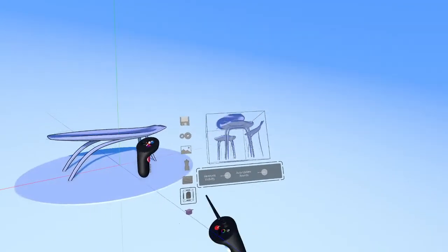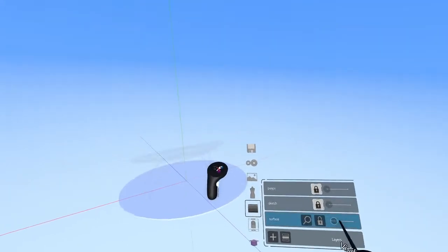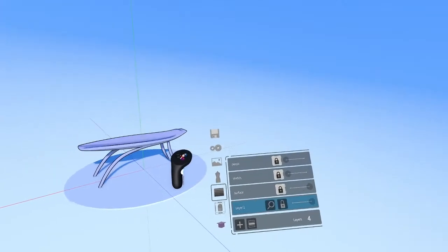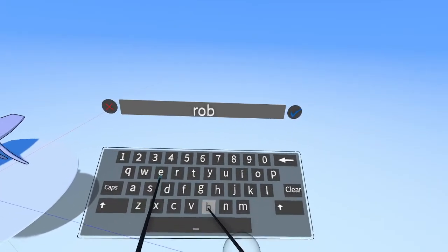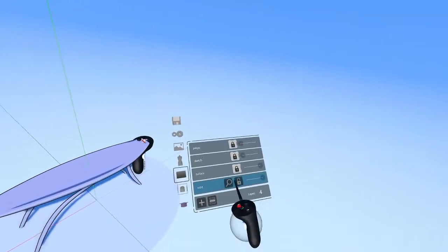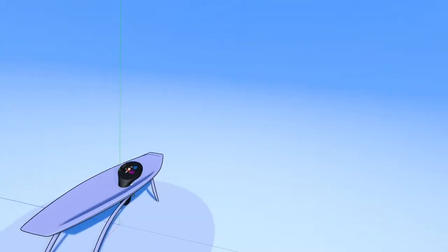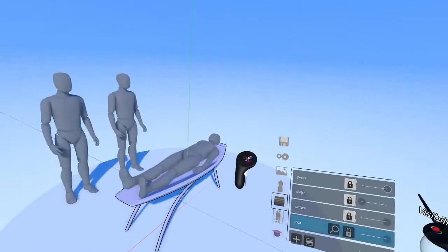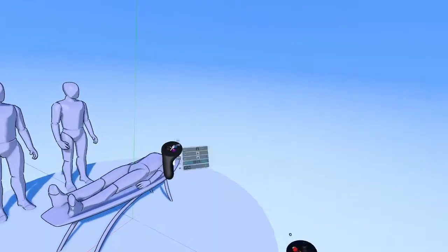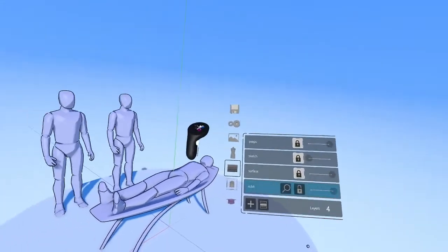But now that we have our bed, let's go back to the layers panel here. Let's turn down the sketch now. We don't really need that anymore. Then let's lock this and create a new layer here for the robot. Oh, robot. All right, we'll stick with that. Again, that's active, and now we can start sketching out the robot. Let's turn on the people again, all the way like this, and then I'm going to grab them and make them the same color and the same material as the table, just so we have something uniform to look at. And let's lock the people again because we don't want to shift or move them around.